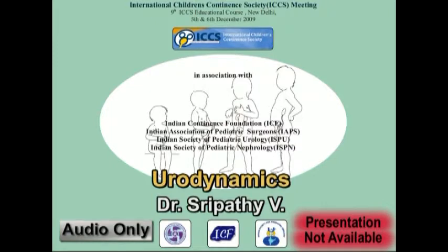But as I said, the time of the ultrasound after the uroflow has been done is pretty critical to decide how much of residue you should take. Now, Uroflow EMG, all the speakers previously spoke about Uroflow EMG. It's a non-invasive test which demonstrates abnormal contraction of the pelvic floor during voiding and can also be used as a biofeedback tool to unlearn this abnormal pelvic floor activity.